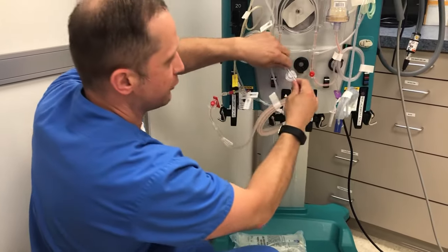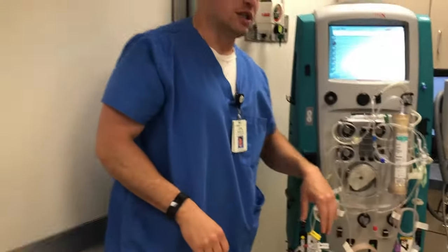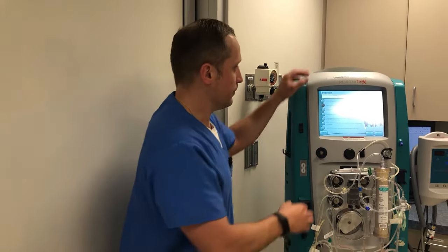And then the one on the left. As you can see, the machine will not let you put those in inadvertently. It'll only let you put it in one way and twist the way that it wants it to go.